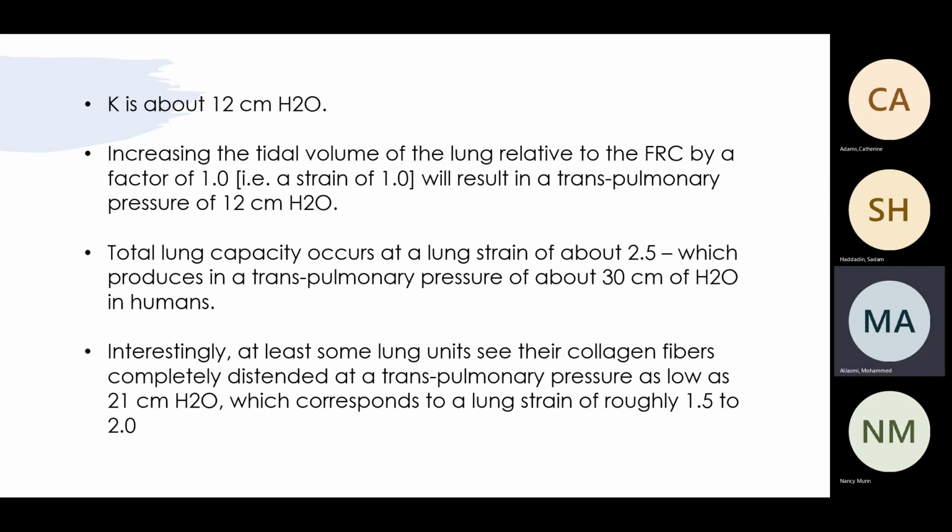That's why when you open any topic right now and read about the esophageal balloon, what do you want? What's the number for the esophageal balloon? You need your pressure during inspiration and expiration. What's the number that you look for? So during expiration, you're looking for 0 to 10. That's the highest. During inspiration, not more than 25. Is that right? Do you know these numbers, guys?